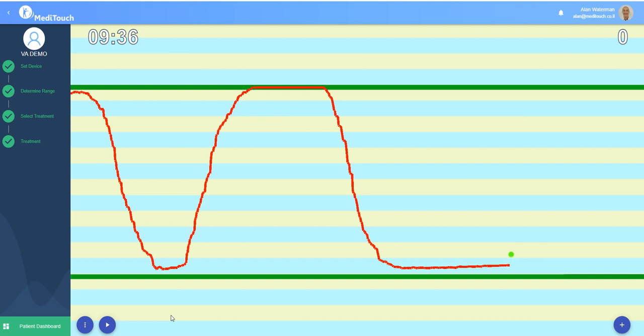We'll put the device on according to where the functional task tells us to put the device, and we'll ask the client or the patient to do that movement, and immediately we can go on to the game, and it's a plug and play. They put the device on, very, very quick. They haven't understood exactly the technology behind the devices, but we've straight away showed them that within 2 or 3 clicks they can go into the system without understanding anything to do with the technology. Okay, so that's the major benefit, the quickness of being able to put on the device.